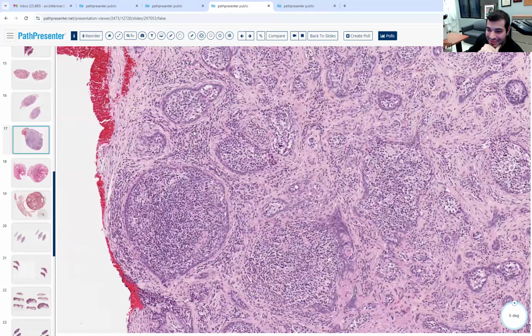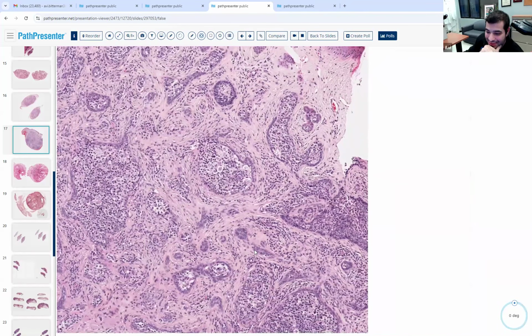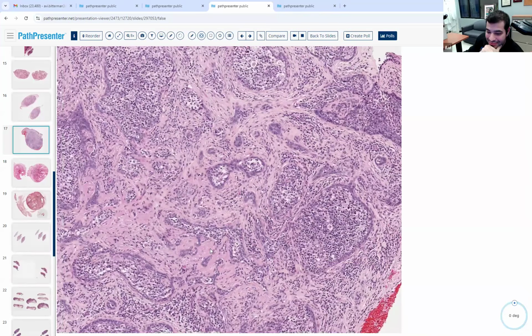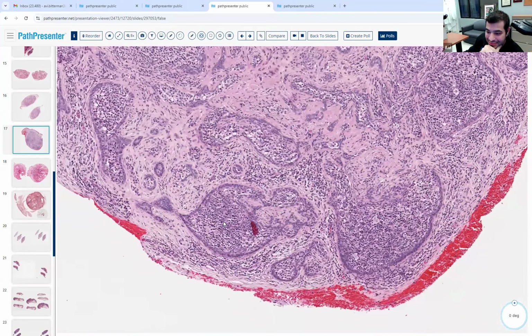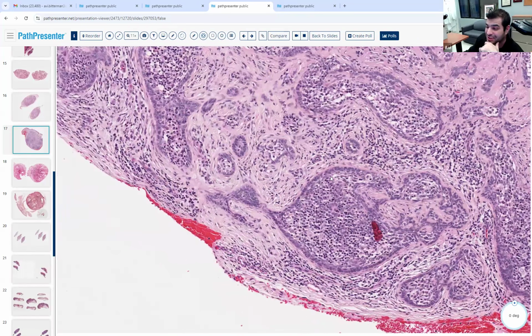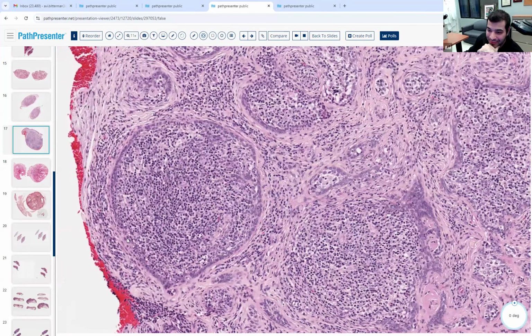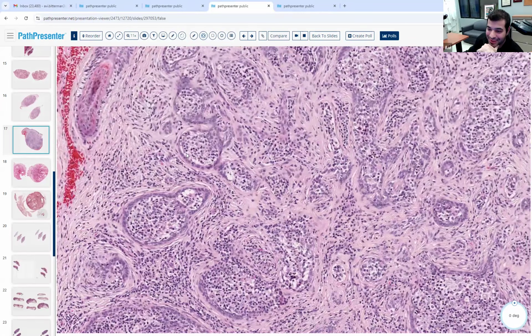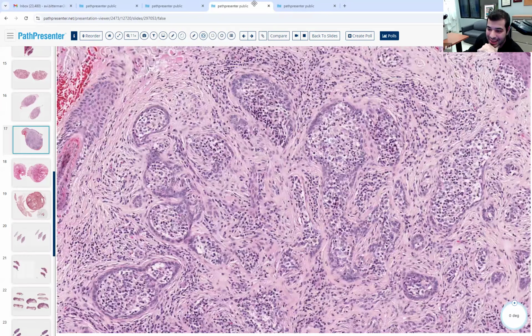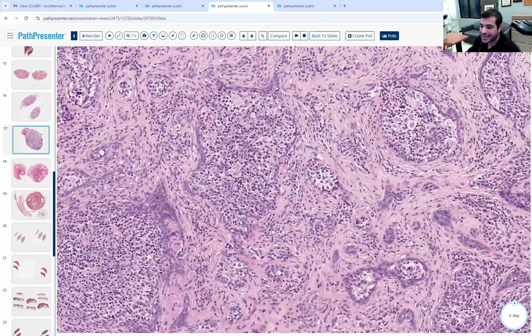So what kind of neoplasm has these structures? It looks like it has some follicular germ here, like it has some reminiscence of the trichoepithelioma or trichoblastoma we just saw. But this pattern is different. It has this cleared out pattern where the cells are really at the sides and they're peppered with lymphocytes in between. Otherwise, same stroma.